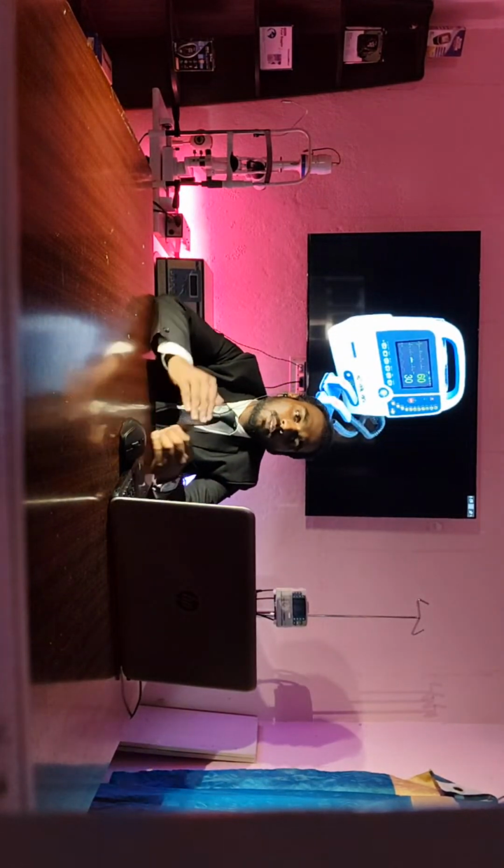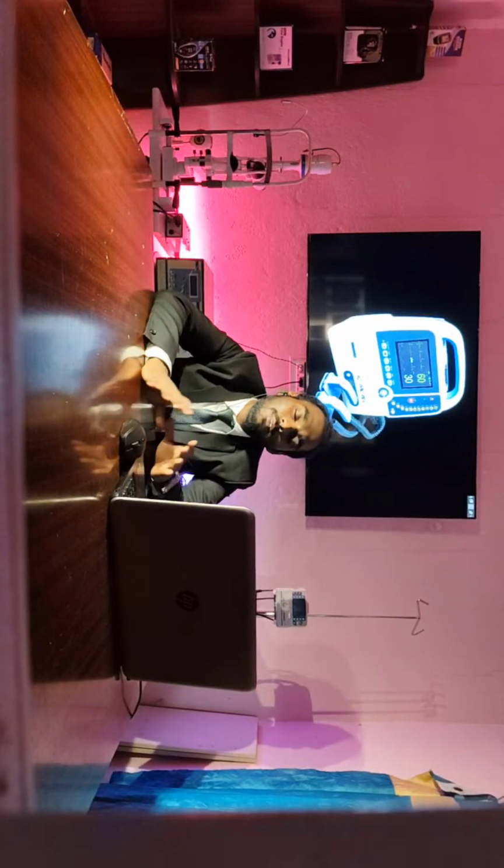After some time, it gives the thermal graph paper as an output. Okay, 150 joules has been delivered properly. So this is the calibration process you need to follow in hospitals.